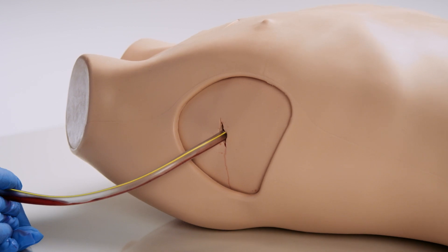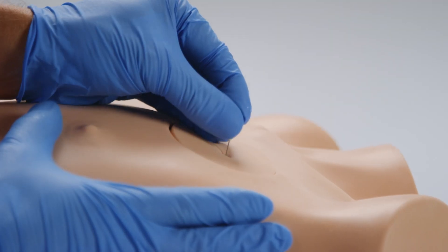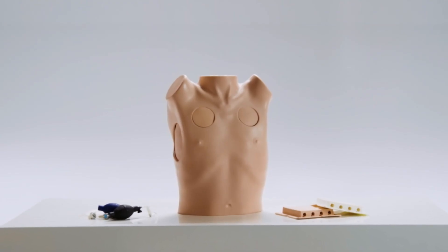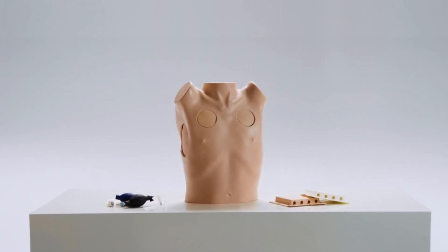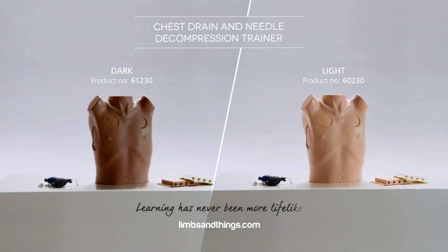Using the needle decompression pad, a needle can be inserted and air aspirated to perform needle decompression. The chest drain and needle decompression trainer from Limbs and Things is a versatile and cost-effective training tool, ideal for group training sessions and ATLS courses.